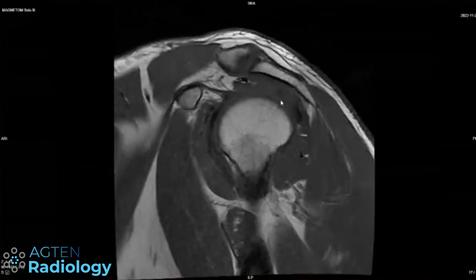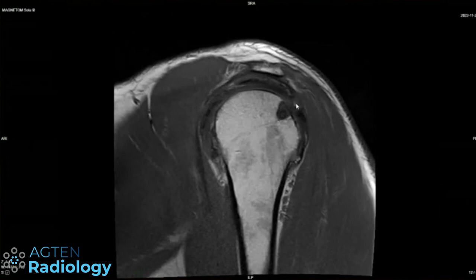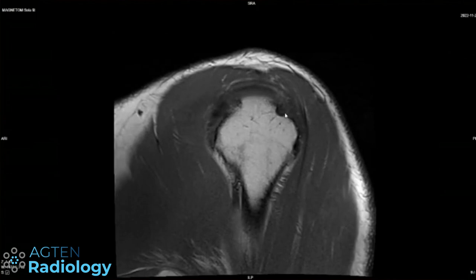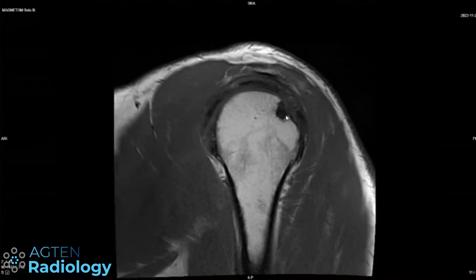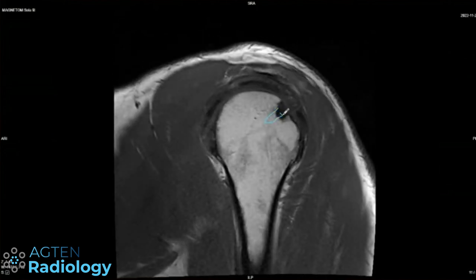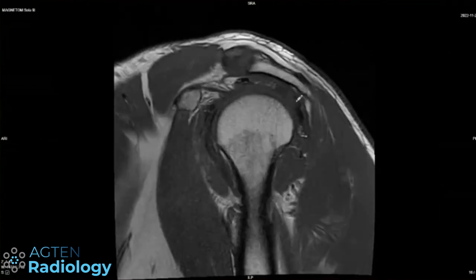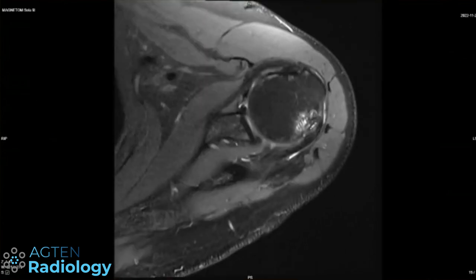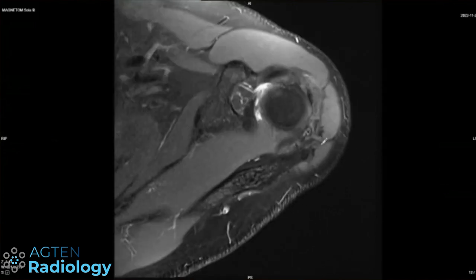Let's scroll and follow the tendon all the way over — we can see it's kind of sitting like a cup here. The angle and vector of the screw is almost tangential, quite parallel to the surface rather than going more steep. There's a lot of coverage missing here, maybe down to this point. A small piece of bone may have been broken off when drilling started from this area — perhaps fractured out a tiny bit and is now here together with the tendon attaching on there.